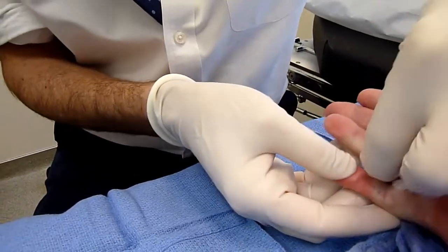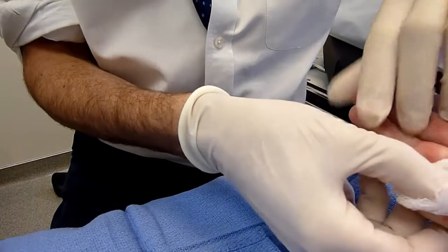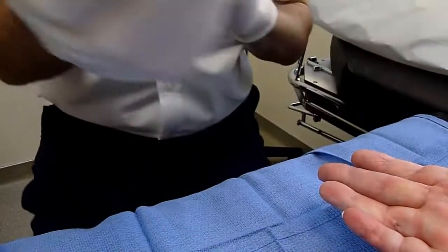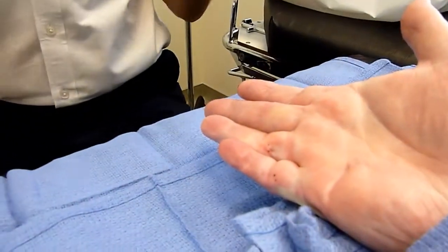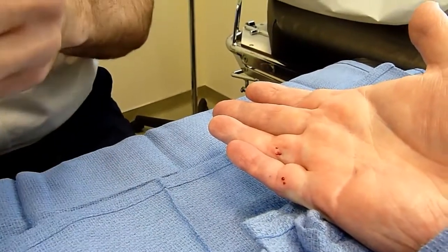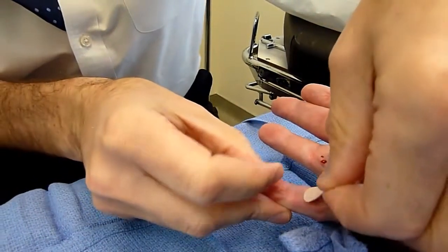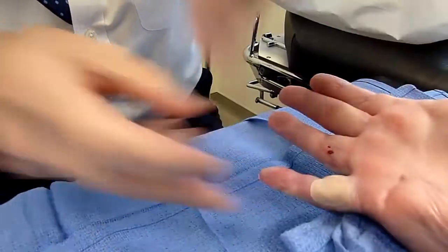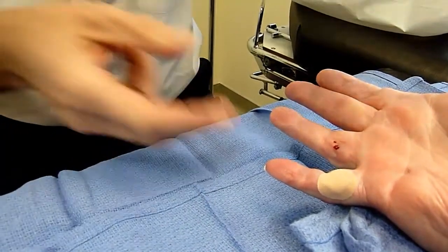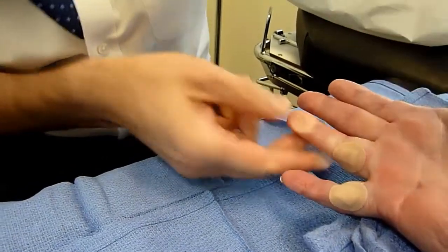You know, the PIP of the small finger you can't always predict because some of those, you feel like there's a definite cord there and it just won't give. Yeah. And I still do enough full Dupuytren surgery. I've done two in the last week. And the biggest thing that I see there is that coming up the side of the small finger is the abductor digiti minimi. That muscle sometimes thickens in a way that I think it is very difficult to release with a needle. Isn't that always cute? Look at how cute that is. All right, that is all you need there. Okay, you have a nice touch.